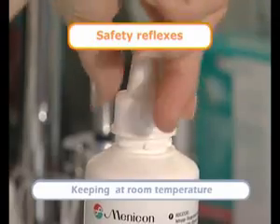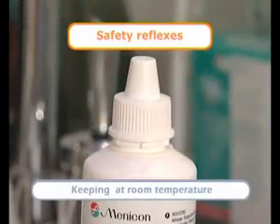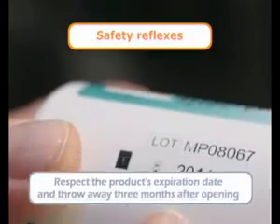Close the bottle after each use and store it at room temperature away from sunlight. Do not touch the tip of the bottle.